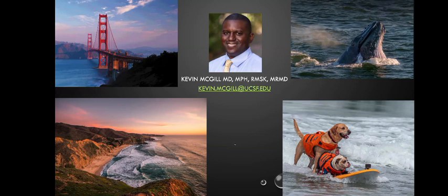We'll take the question from Dr. Pua. Go ahead. Hi, sorry. Good morning. Sorry, it's morning here. I just have a follow-up question with regards to the ATFL sprain. Is it okay if we don't call it, if it's as subtle as an intermediate signal on T1? Is it okay if we don't call it, or will it impact a lot clinically?